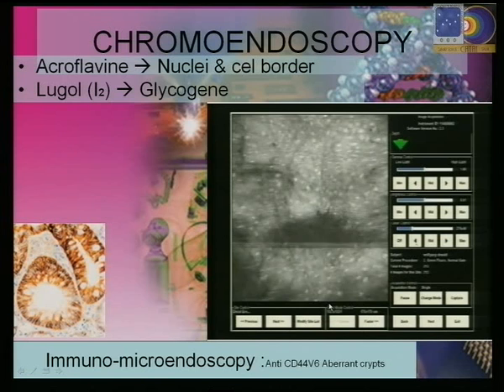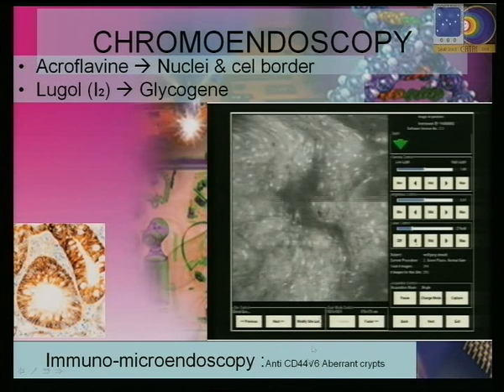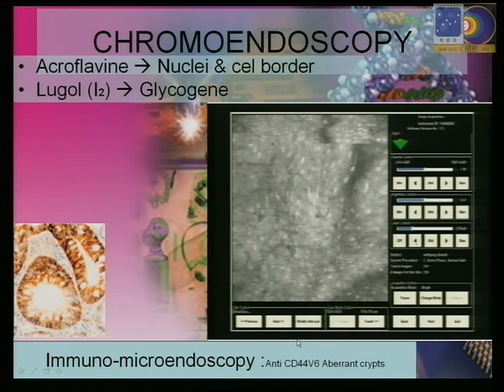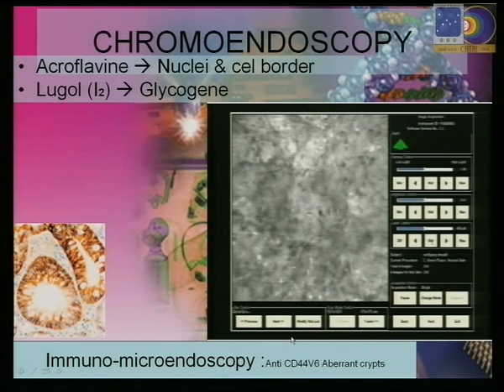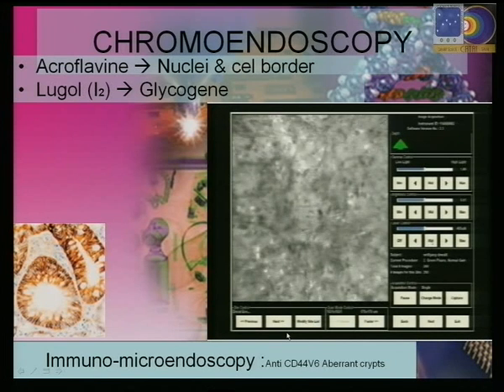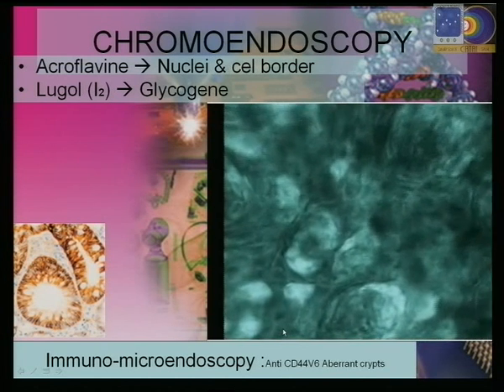The number of moving artifacts can be minimized by gentle pressure of the distal tip of the endoscope onto the mucosal surface and by continuous suctioning. After stabilization is reached, suspected areas can be imaged over the whole imaging plane depth. Here, irregular cell architecture indicates squamous cell carcinoma. The different confocal images can be digitally captured with the help of a foot pedal. Online obtained images can also be reassessed at any time after the procedure.